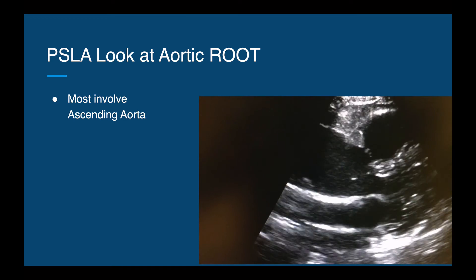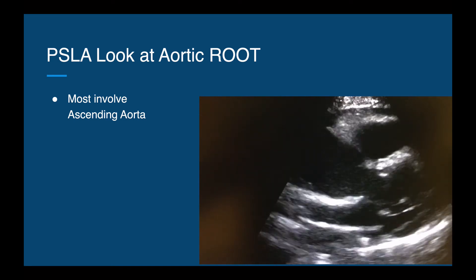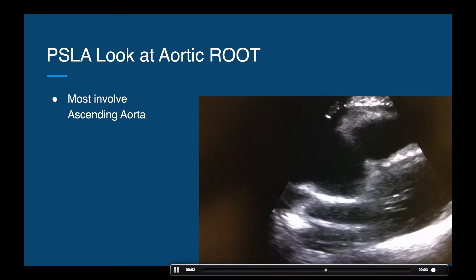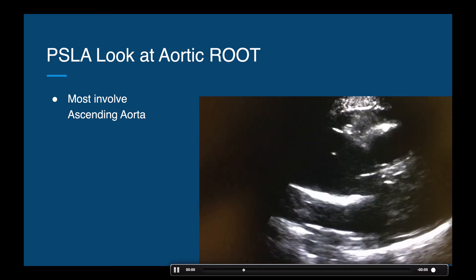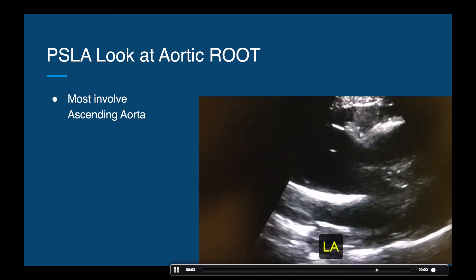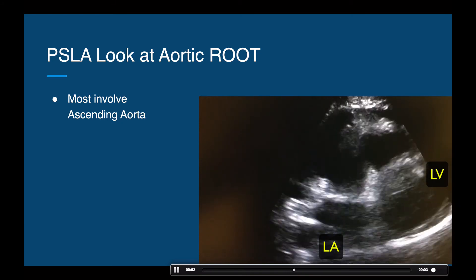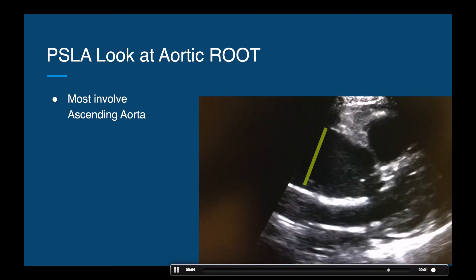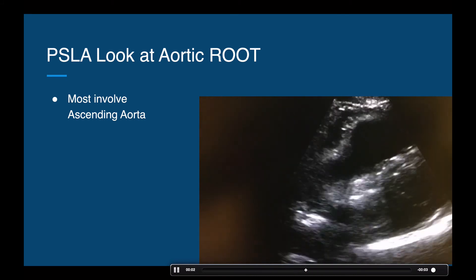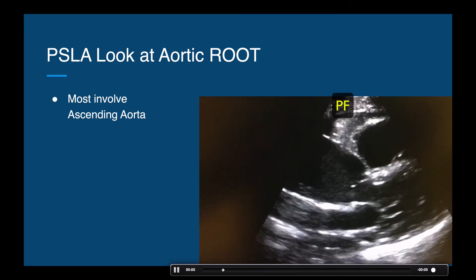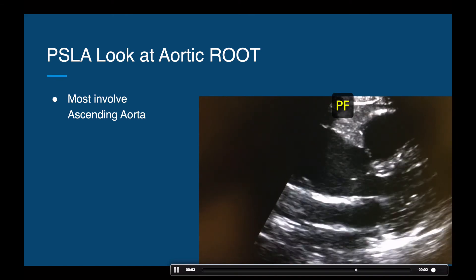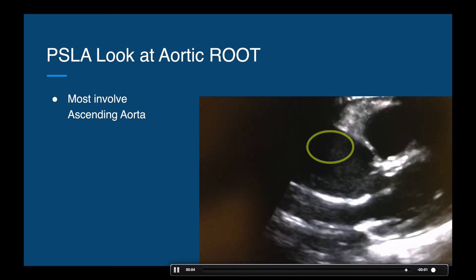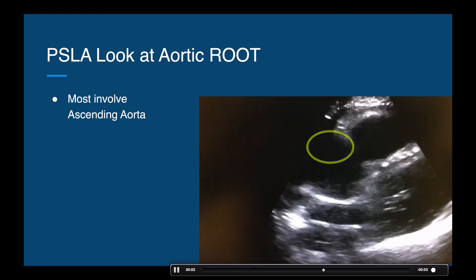Most dissections occur around the aortic root, so we usually start with a parasternal long axis view of the heart. Here we see the left atrium, the left ventricle with the mitral valve, the aortic valve, and a dilated aortic root — the root should be about the same size as the left atrium. We also see pericardial fluid or blood, which makes us very concerned, and then a flap that does not involve the aortic valve — making us think we are dealing with a very deadly dissection.